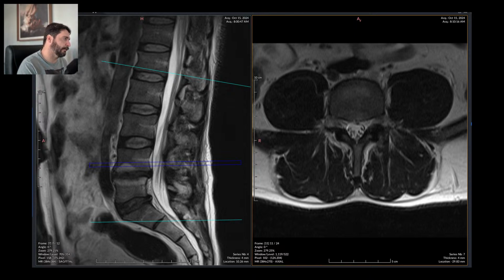And we have a fracture with pseudarthrosis of the isthmus of the facet joints of L5S1 on the L5 side. Which is also quite common. This is called spondylolysis.